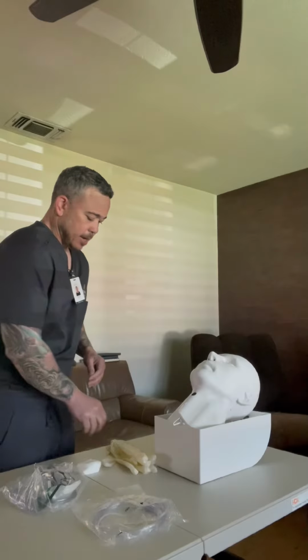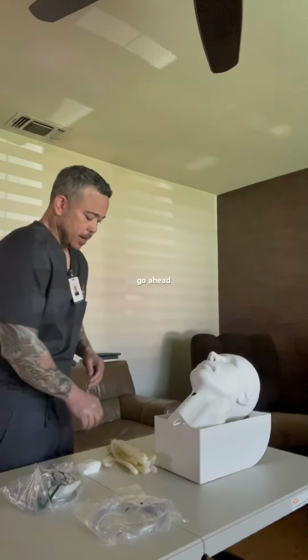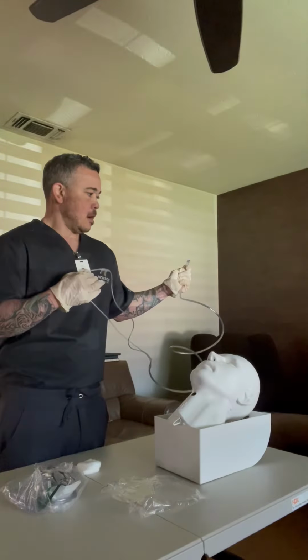For the purpose of this video, we're going to go ahead and state that the doctor has prescribed 3 liters. So 3 to 4 liters of the humidification. Humidification prevents drying of the nasal and oral mucous membrane.